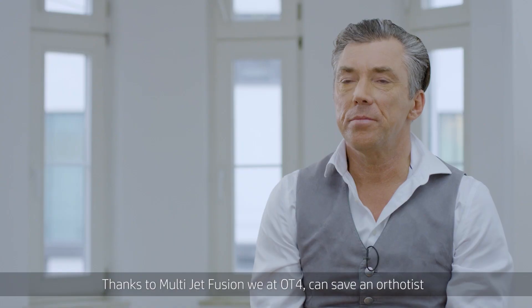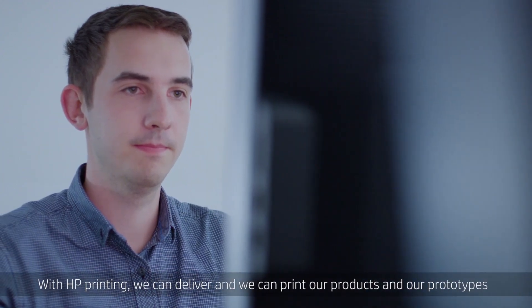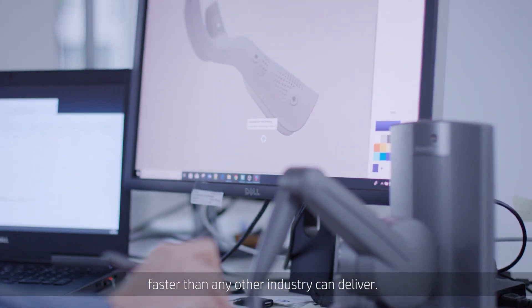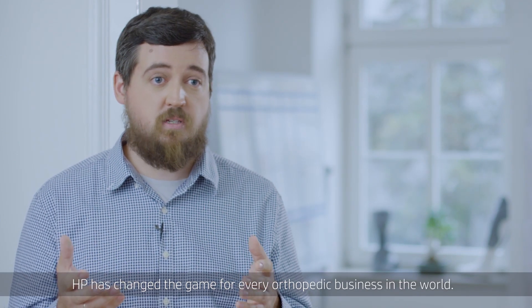Thanks to the Multi-Jet Fusion process, we are able to replace 10 hours of work by an orthopedic technician with HP printing. We can print our products and our prototypes faster than any other industry can deliver. HP has changed the game for every orthopedic business in the world.